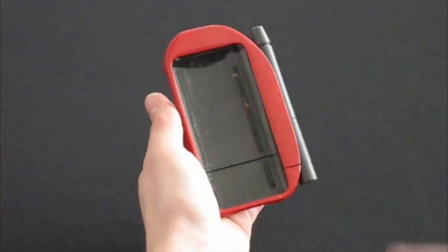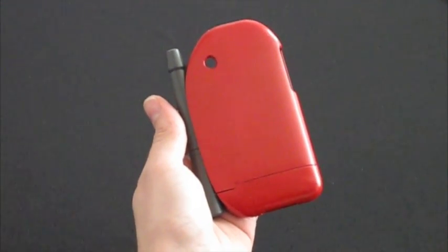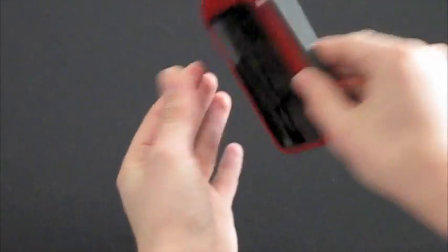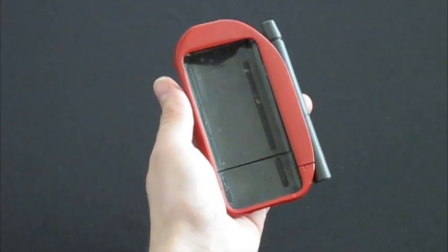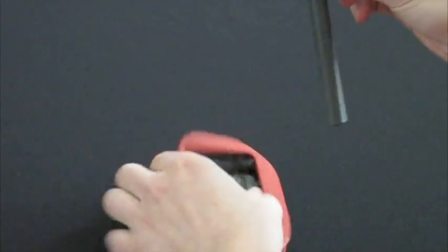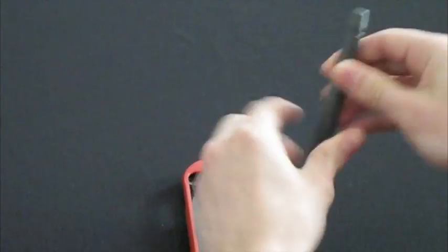LifeCase is an iPhone accessory that allows users to manage all aspects of their diabetes from the phones they already carry, letting them leave their cumbersome equipment cases and logbooks at home, and pumps concealed. This hardware component integrates a glucose meter, lancer, and strip storage into a protective iPhone case.